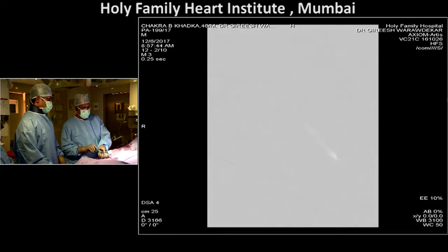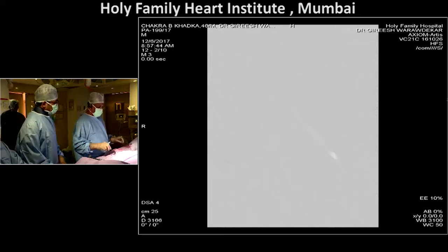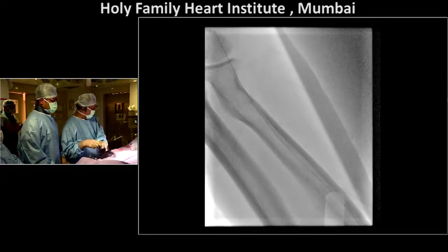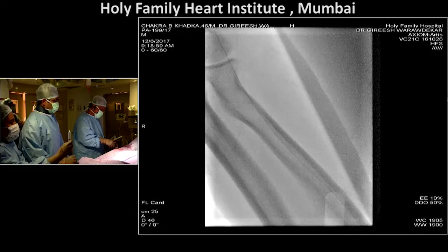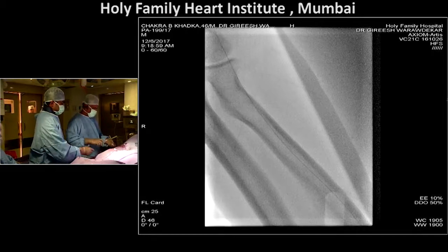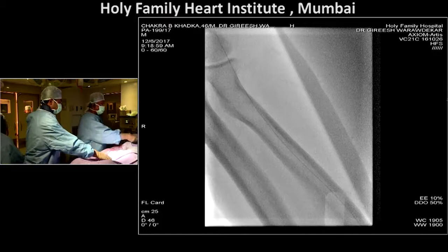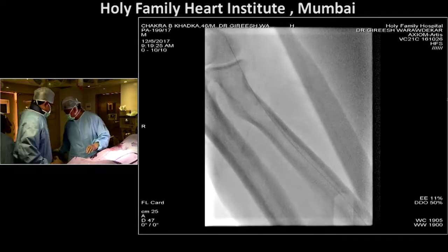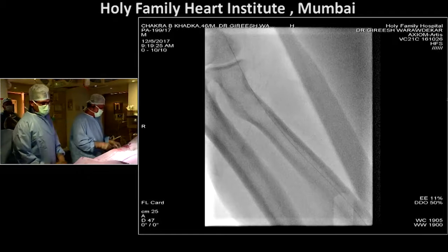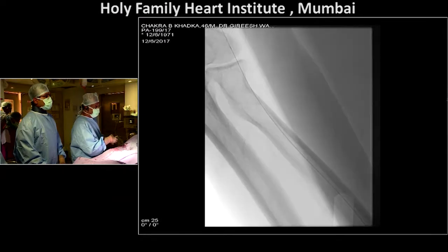So I've just balloon dilated that segment at low pressure. How often do you do balloon dilatation if there's a spasm? I mean, you've done NTG, but then you still have a spasm there. Have you used balloon to open that segment? Anybody in the audience, Manish and Ramesh? I think sometimes resistant spasms can be relieved with a slow, lower inflation with the balloon. We've often done that in the peripheral, and neuro is another area where we keep doing this. It sometimes sounds a little funny, because the spasm is primarily from stimulation of the wall and you're further stimulating it. But low pressure dilatation has helped sometimes to open these flows rather than having a thrombus.